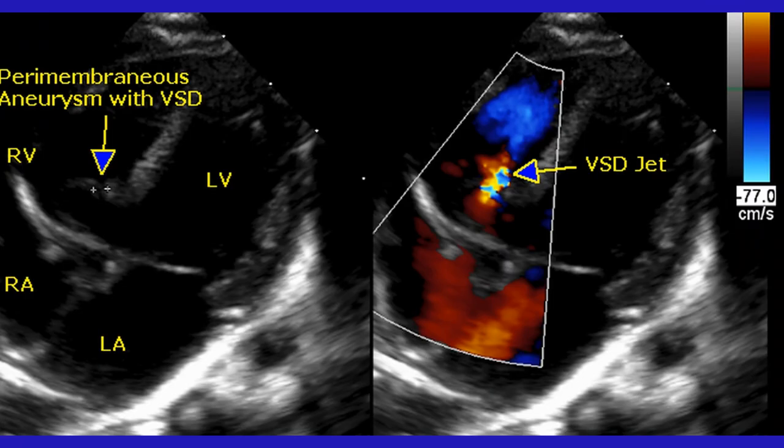Locations of atrial septal defect are sinus venosus, secundum and primum, starting from the upper end of the septum downwards. Primum atrial septal defect is usually associated with regurgitation of atrioventricular valves. Locations of ventricular septal defects may be mentioned as outlet, perimembranous, muscular, or inlet. Outlet is just below the pulmonary valve and inlet near the atrioventricular valves.